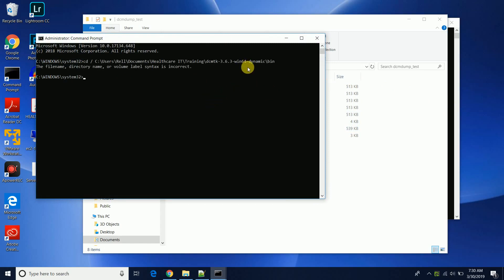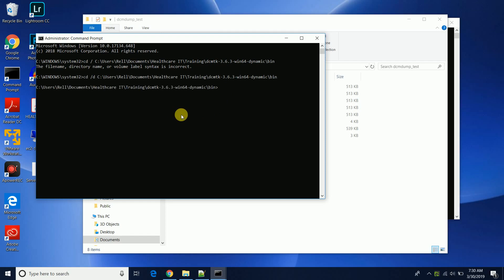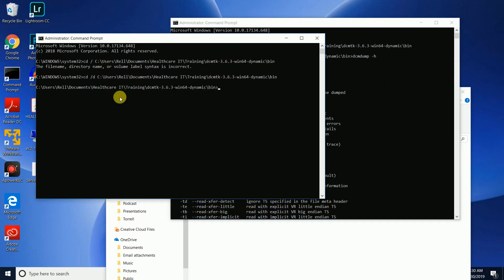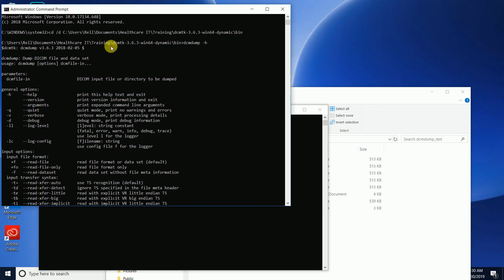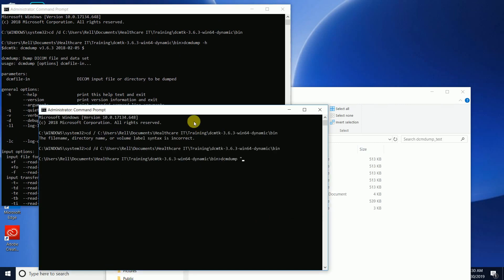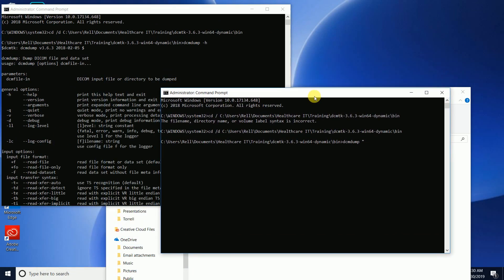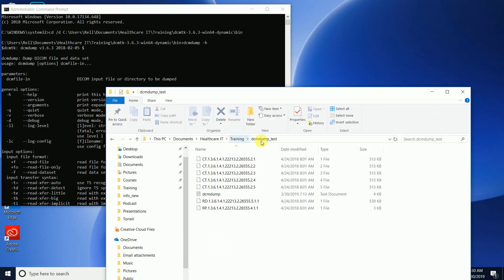Let's go to our bin directory. I'm gonna do DCM dump and so we just need the input directory, right. The parameter is just going to be the input directory, either file or the directory. So let's come back to our test here, we'll copy that location.